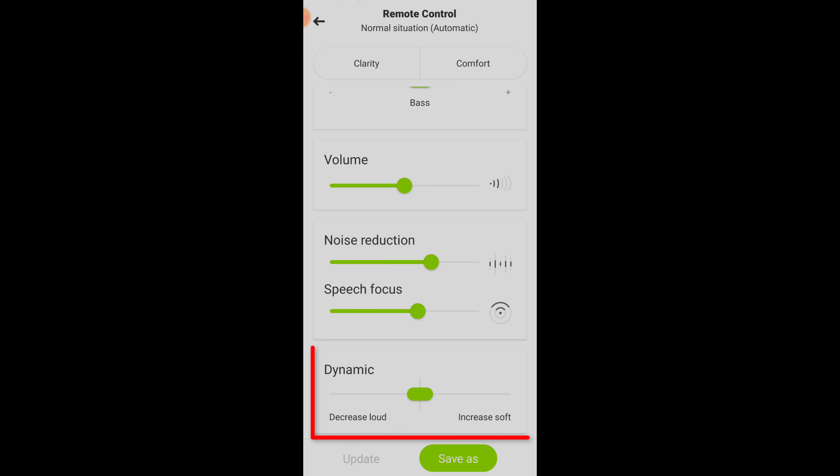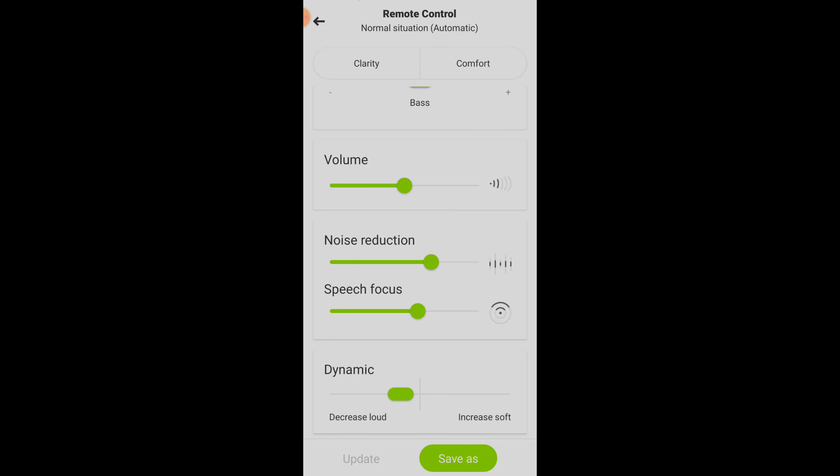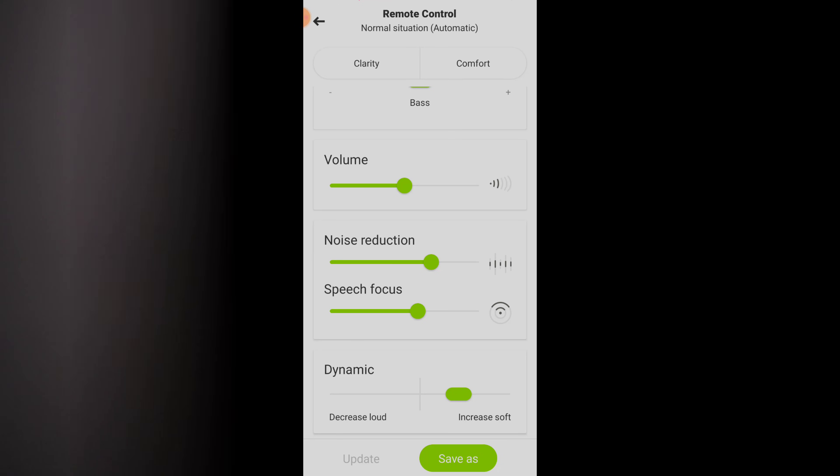Last but not least, the Dynamic section allows you to adjust compression settings by either reducing amplification for loud sounds or increasing amplification for soft sounds. One piece of advice I always give my patients is to only adjust one of these parameters at any given time. Take it to the extreme in one direction, then the other, and identify if that adjustment is actually giving you benefit. If you just start moving everything around expecting to hear better, you're probably not going to find settings that work for you.